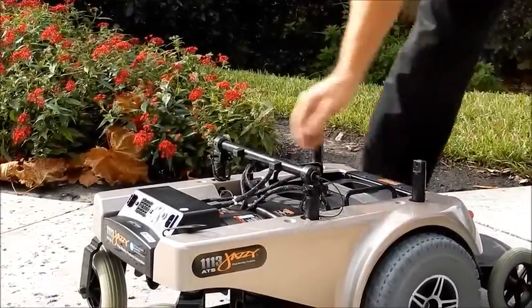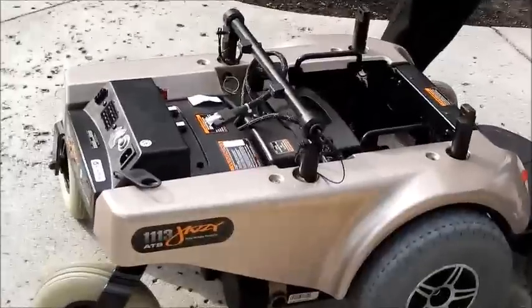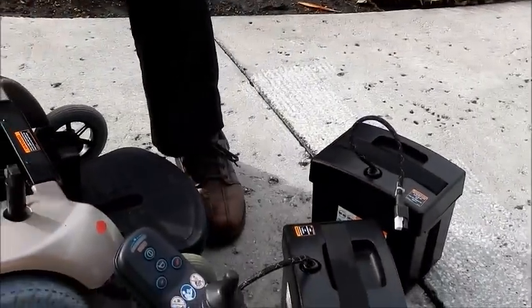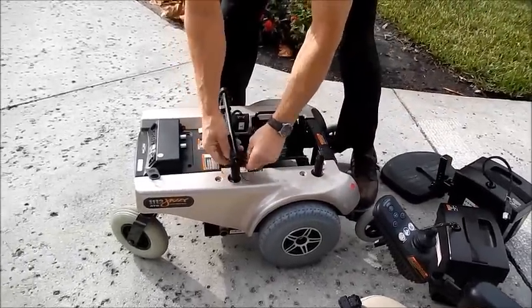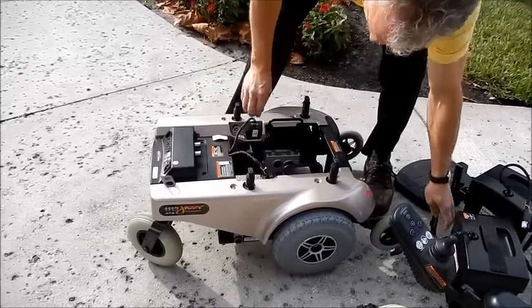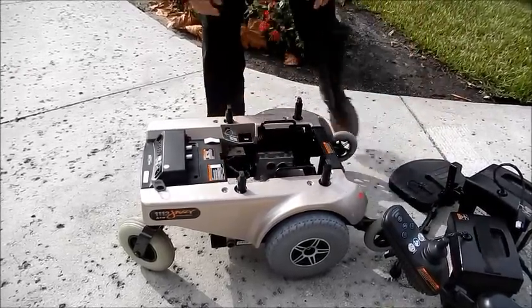Disconnect the two batteries — one, two. Take the foot plate out. You can take these two pins out also. Just disconnect the motors. All done in less than two minutes.